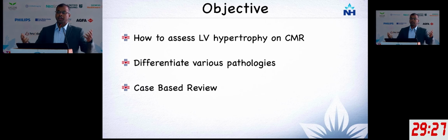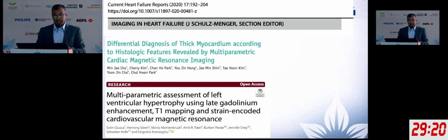I'm going to ask you guys to contribute and try and make up your mind as to what you think is the pathology. These are some of my references, so if you're interested, take a picture of this so you can also refer to them in future.